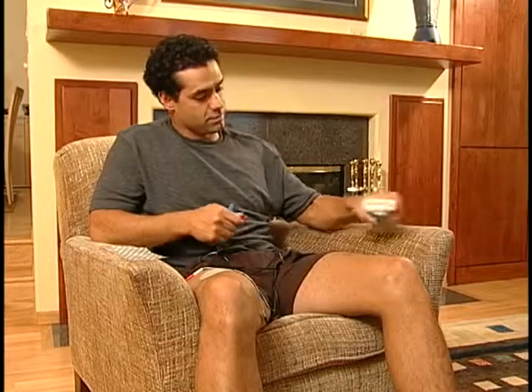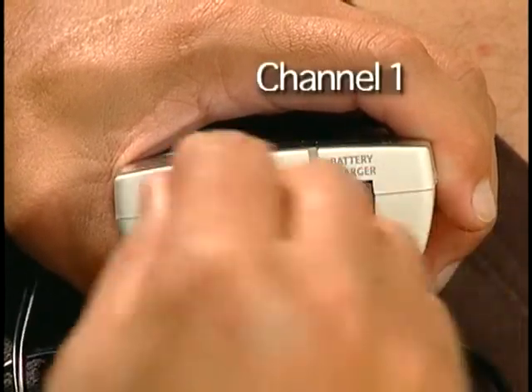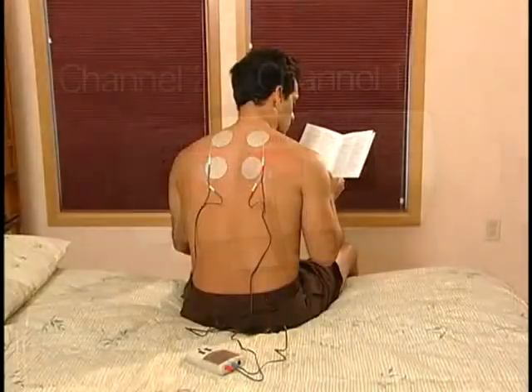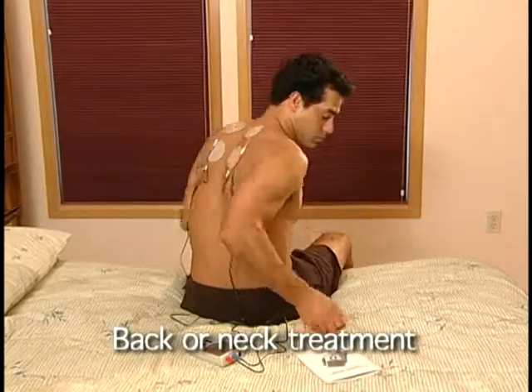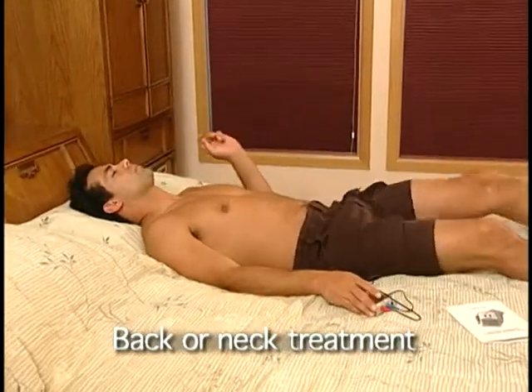Next, plug the cables into the channel jacks on the top of the stimulator. Use the cable colors to place the cables into the correct jacks. If you are taking a treatment on your back or neck, sit or lie down so that you are leaning against the pads. When the pads are pressed against your skin, you will increase the comfort of the stimulation.